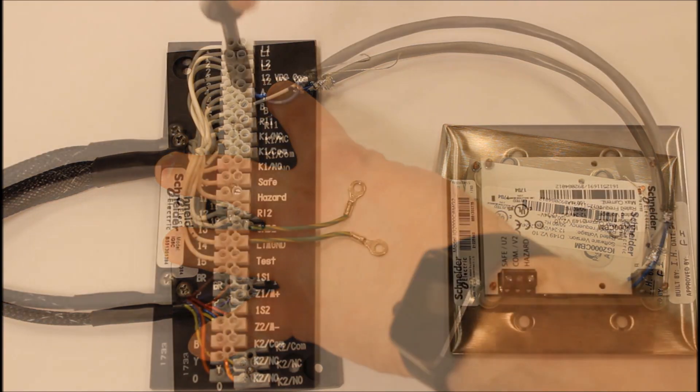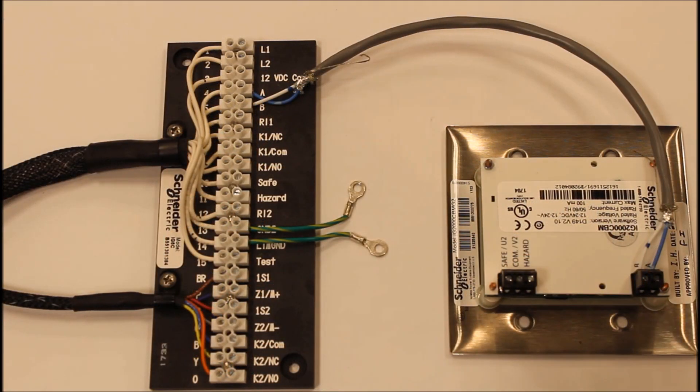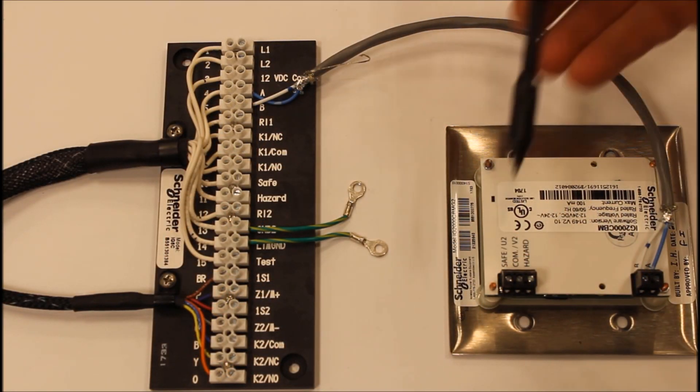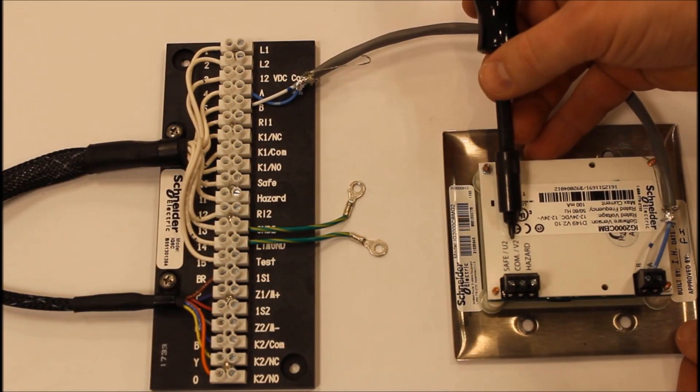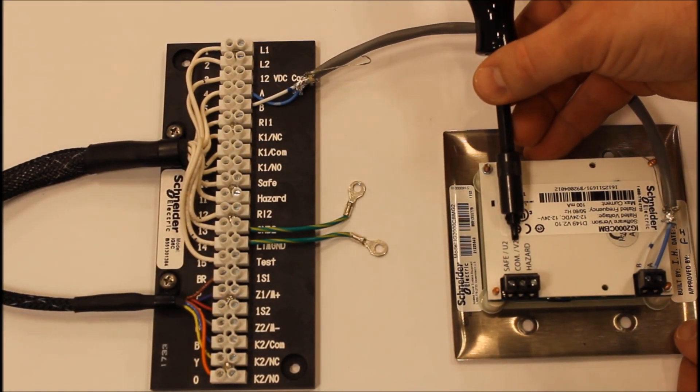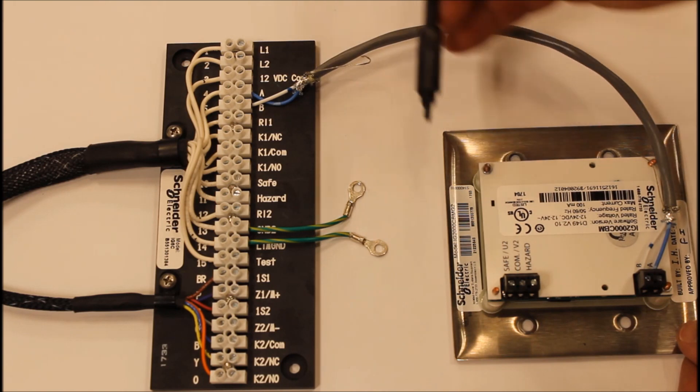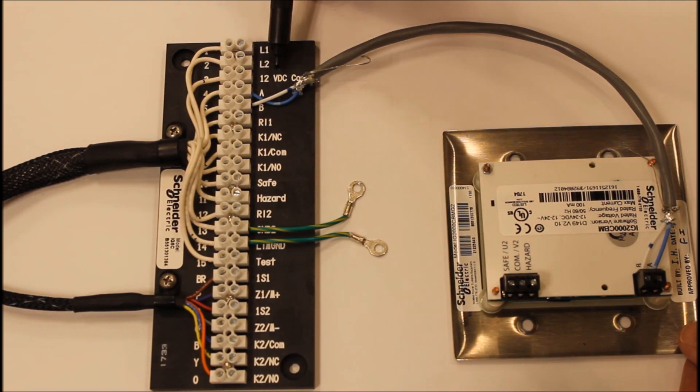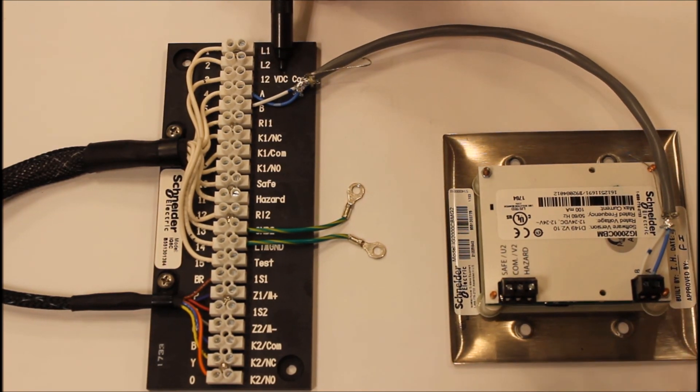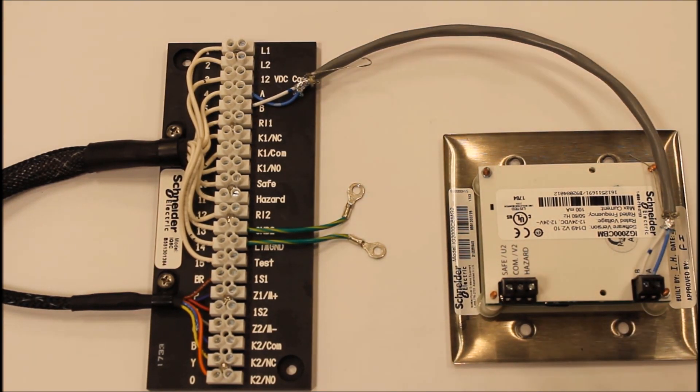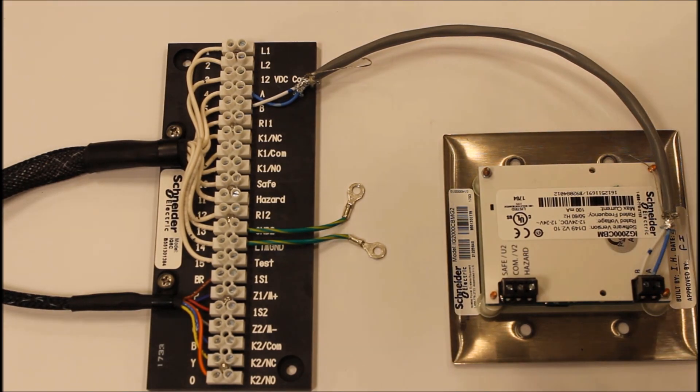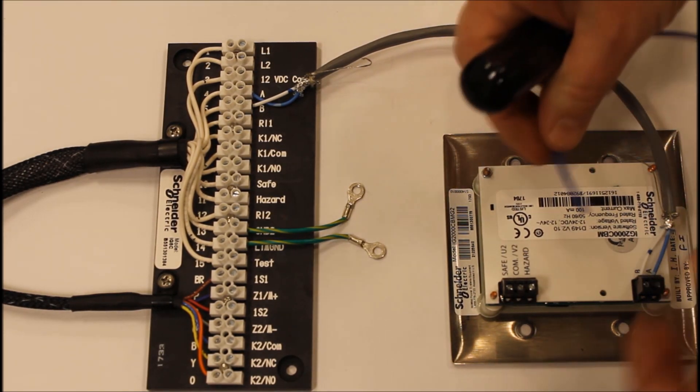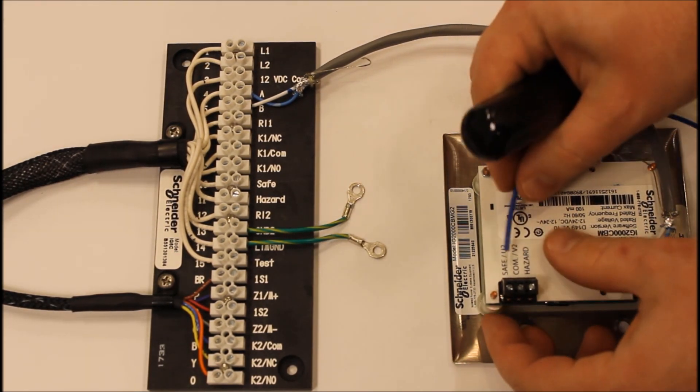Once we've made that connection, now we're ready to connect our safe and hazard and our common. Let's start by using the common and wiring that to the common onto the connector plate.